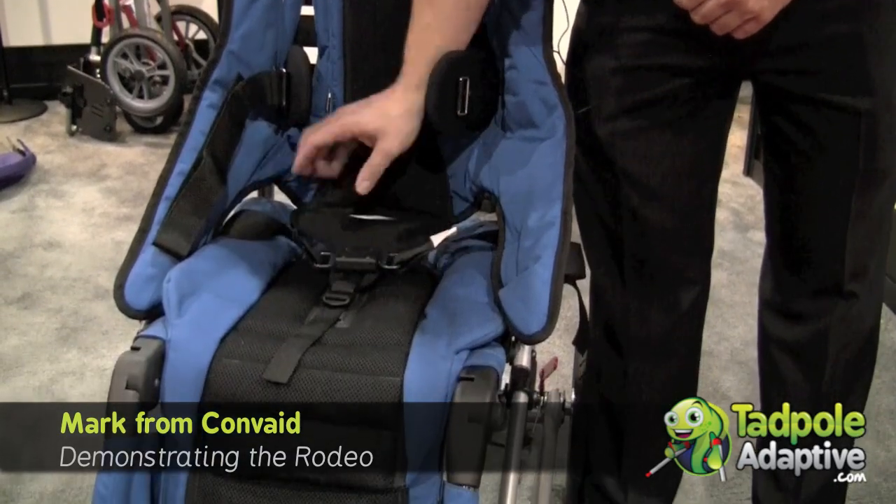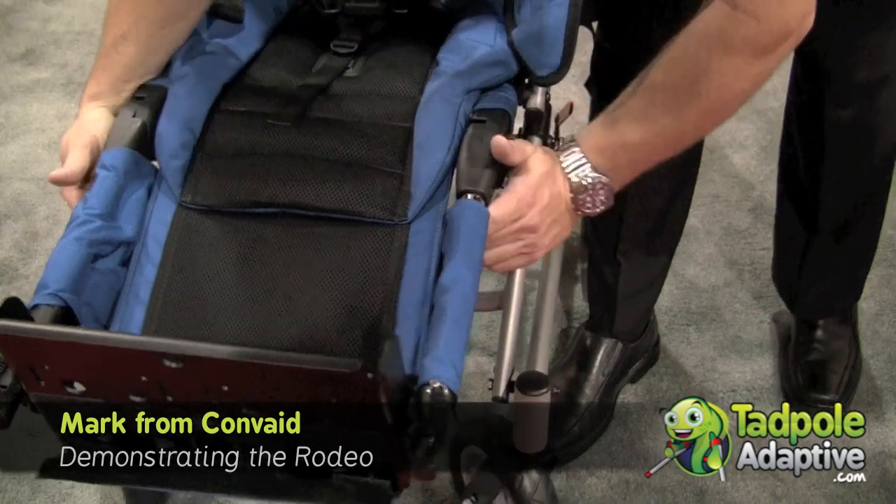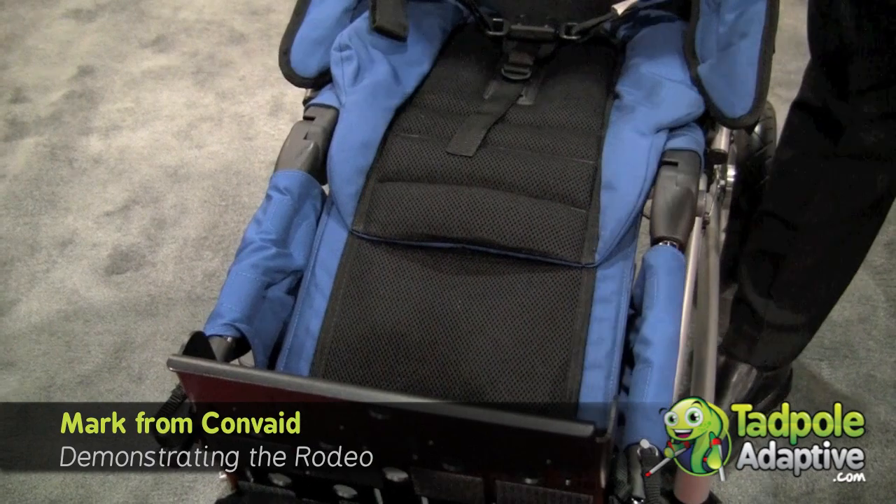You can also get it with a three-point belt or a two-point positioning belt. It has an elevating footplate, very easy to use, and also a height-adjustable footplate that's angle-adjustable.